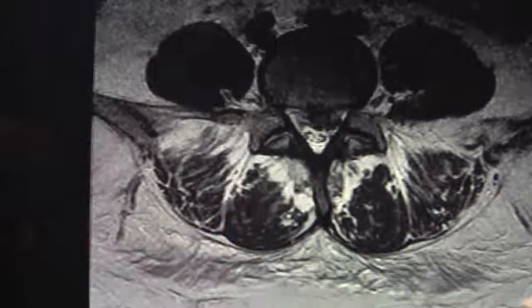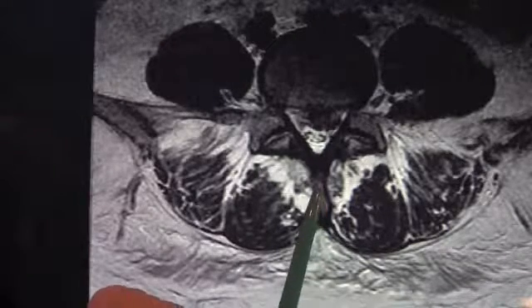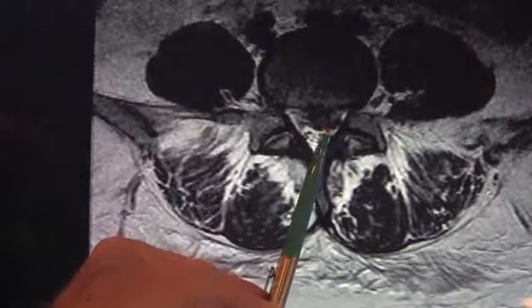At the time of the microdiscectomy surgery, we'll be making a small incision and going down and moving the muscle out of the way. We'll be making a small opening here to take the pressure off the nerve.